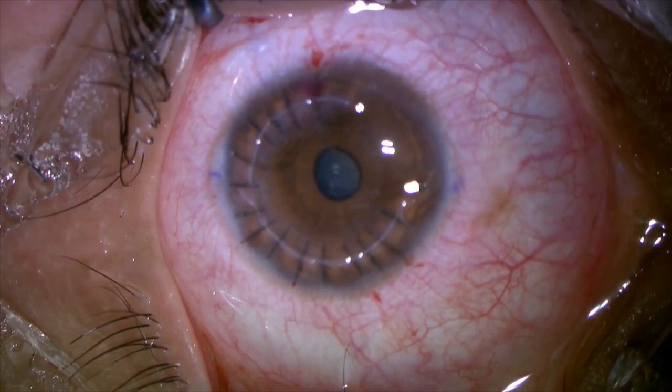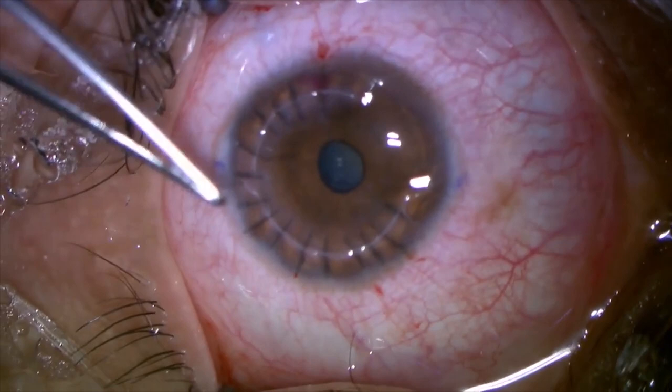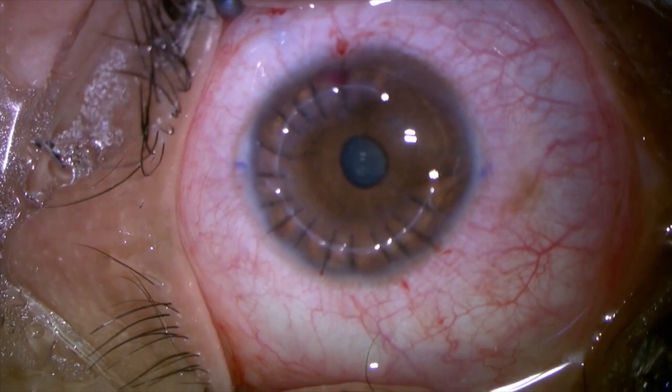Yeah, so we finished. Again, as you can see, the apposition of the edges is perfect. Sometimes you have to just change one or two stitches. As you can see, there's a nice flattening of the cornea. It looks actually pretty good.